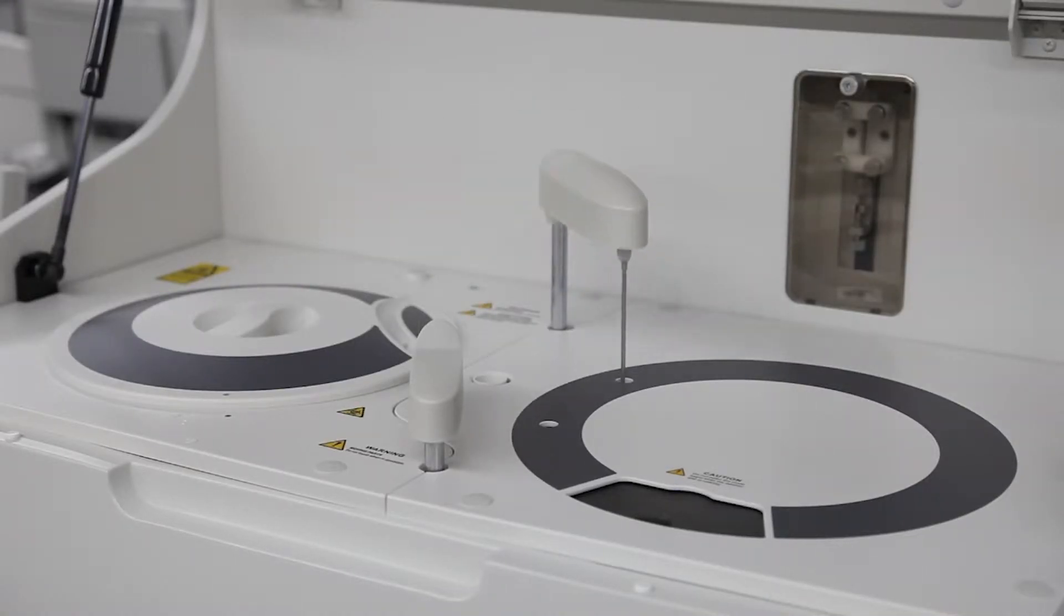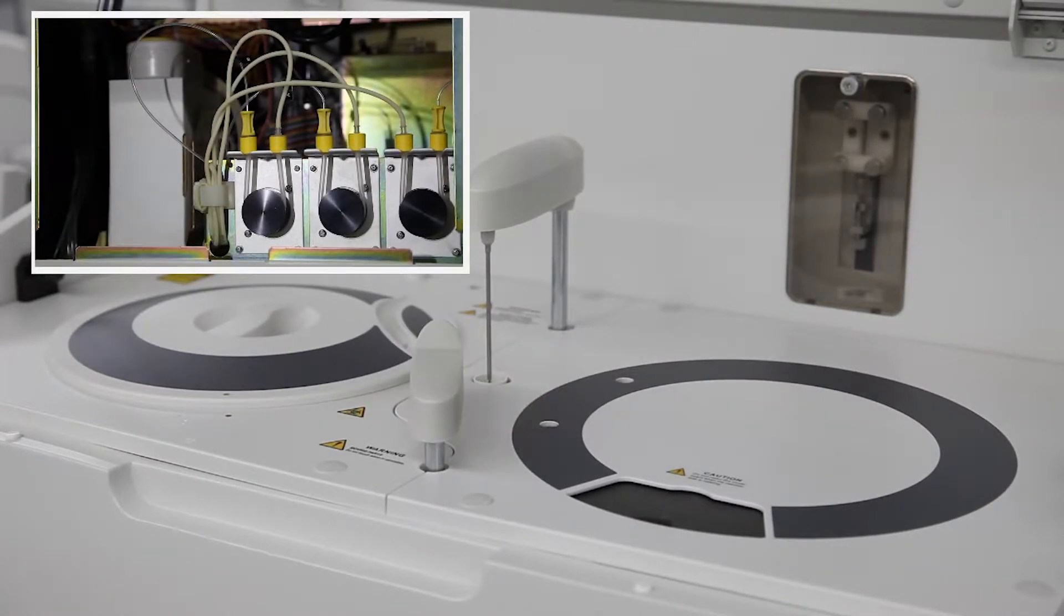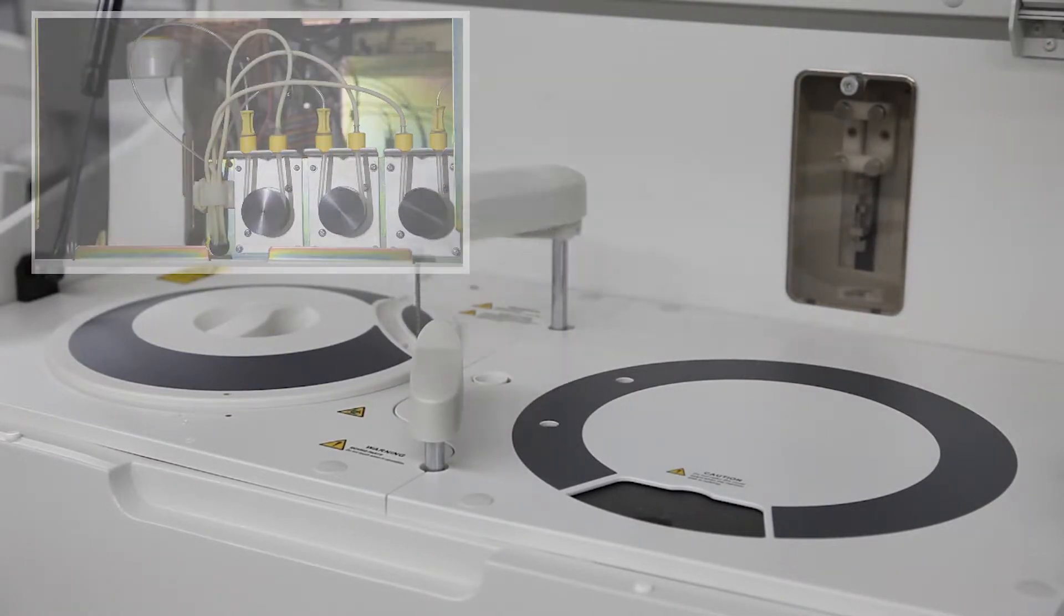The BS200 offers 200 tests per hour throughput. With the optional ISE module, it enhances the throughput to 330 tests per hour.